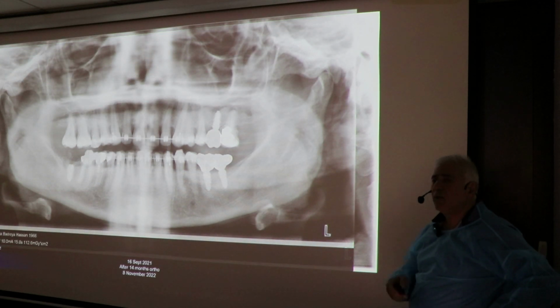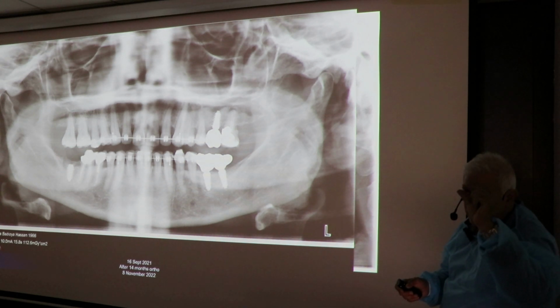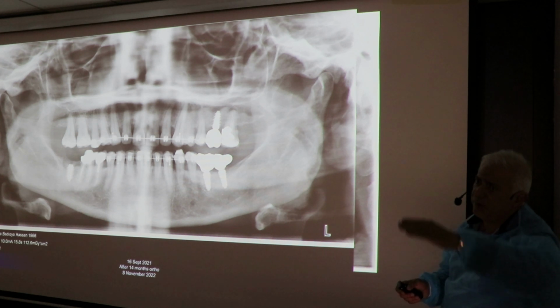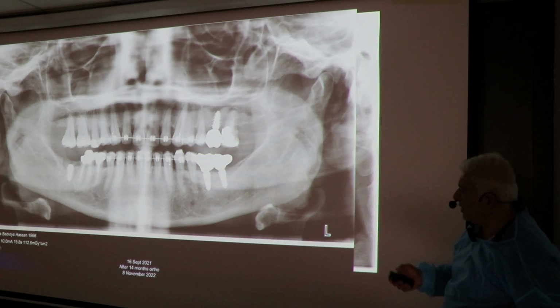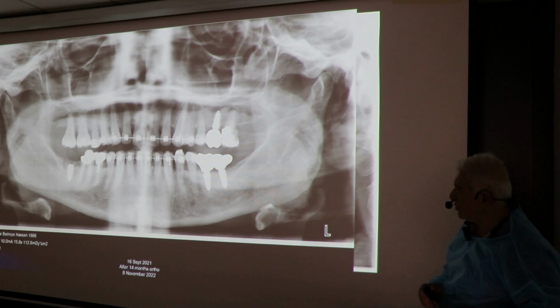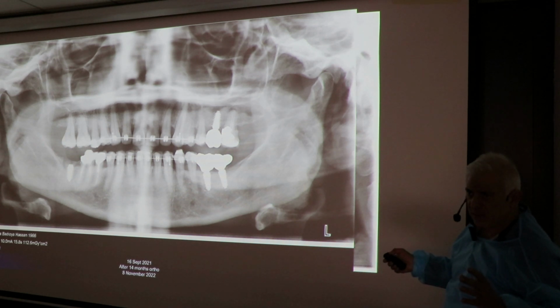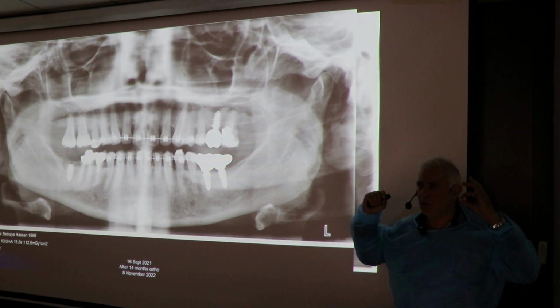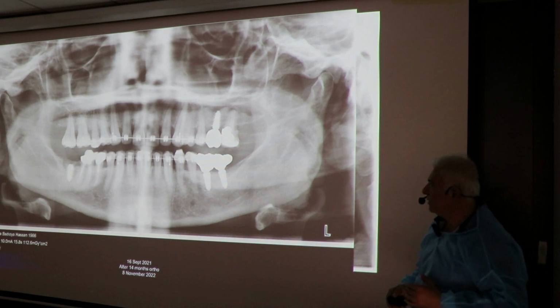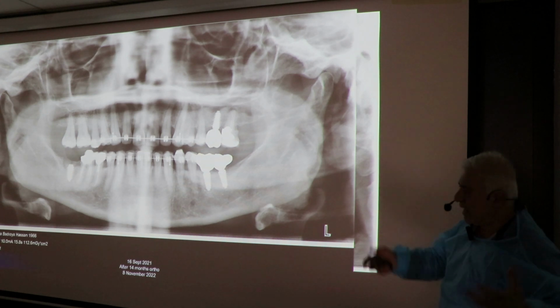The lucky part was we are dealing with the maxillary bone. So we could intrude maximum 1.5 millimeters after 6 to 8 months, which was enough, maybe because also the bone was not extremely dense around those teeth. But finally we got enough room to place normal size crowns, and of course we had to take care of the entire dentition in terms of her centric, everything was proper. Once we regained her vertical dimension, we were able to give her a good looking standard size implant.